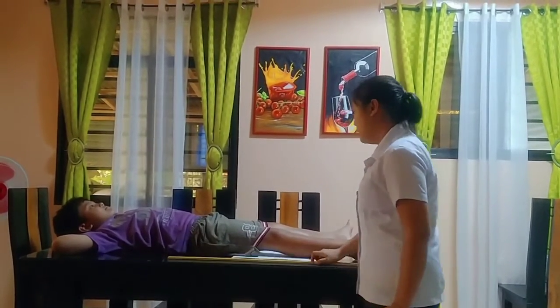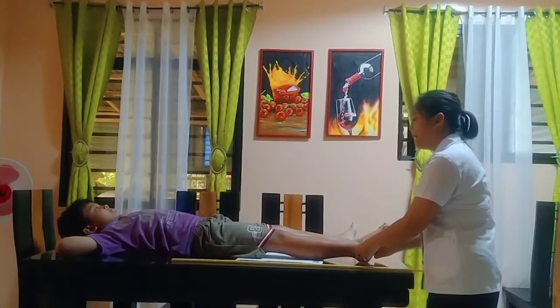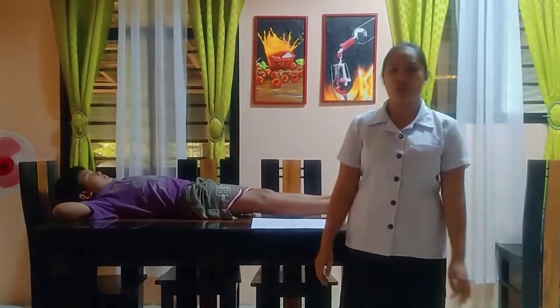Now, ensure po natin na hindi gumagalaw ang paa ng pasyente during exposure. Ayan. This projection shows the open femoral joint space, the proximal tibia and fibula, and also the distal femur. Next projection will be the lateral projection of the knee, but in medial-lateral projection.